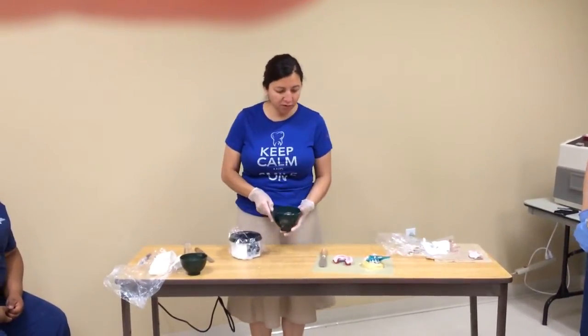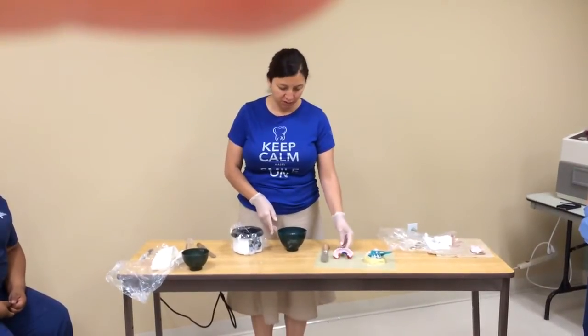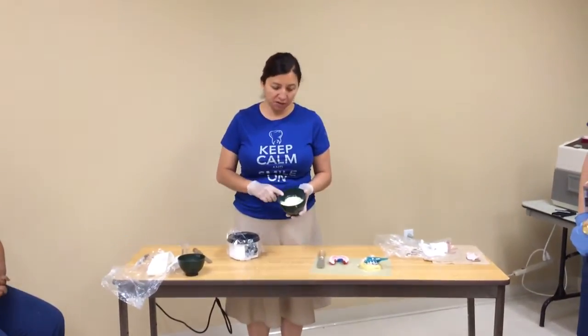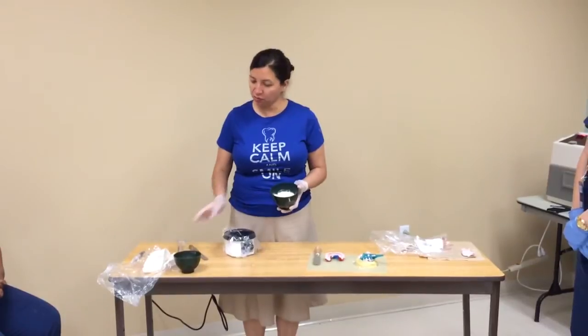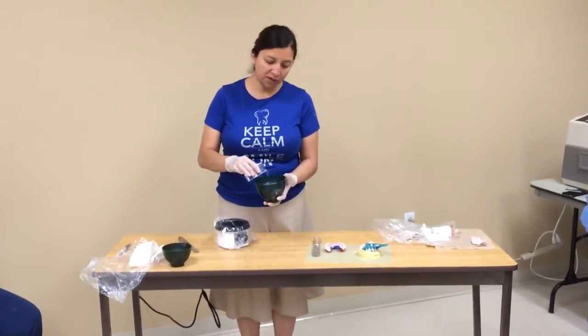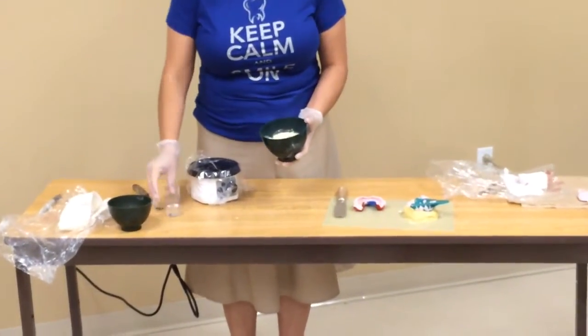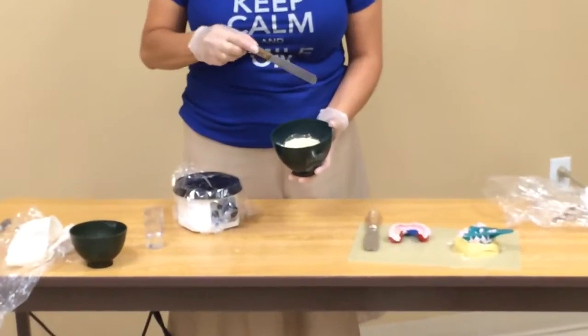Today we're going to pour the mandibular impression into stone. I used seven scoops of stone and one vial of water. I'm going to take the water and place it into the stone and let the water incorporate into the stone slowly.